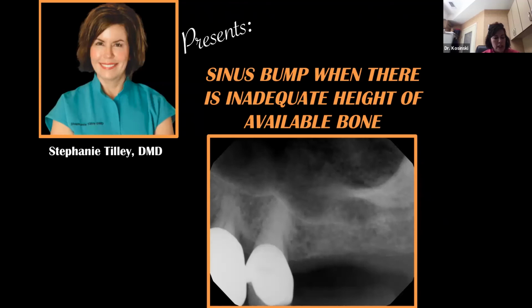It's common to see large sinus spaces in the edentulous maxillary posterior region, where we wish to consider dental implant placement and implant retained crown fabrication. Tooth roots act like a tent pole holding up a circus tent in this region. Removing the tooth, or the tent pole, causes the circus tent, or sinus floor, to collapse, resulting in a larger sinus area and minimal bone for implant placement.